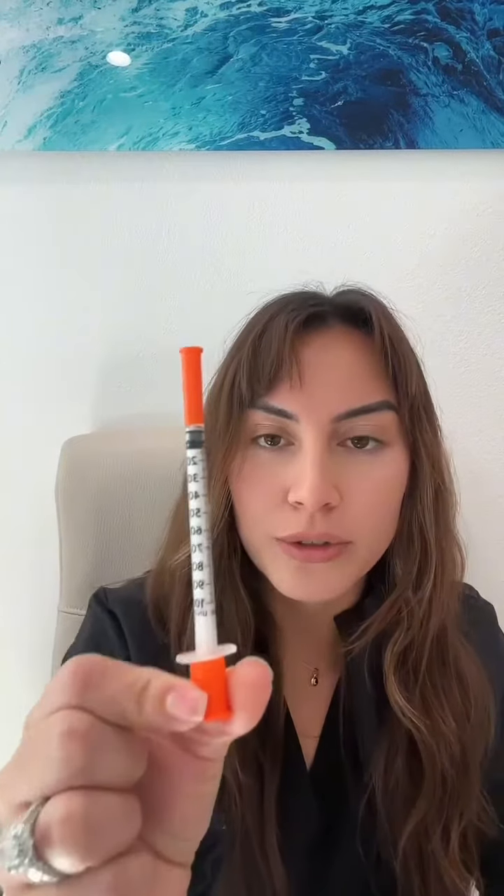Hey guys, it's Marv's DRN for Invigorate Wellness. I wanted to come on really quick and do a video showing you guys what you should be drawing up for your first dose of semaglutide. This is the insulin syringe that you receive when you get the package delivered to your doorstep. A lot of people are accidentally injecting 50 units instead of five units.